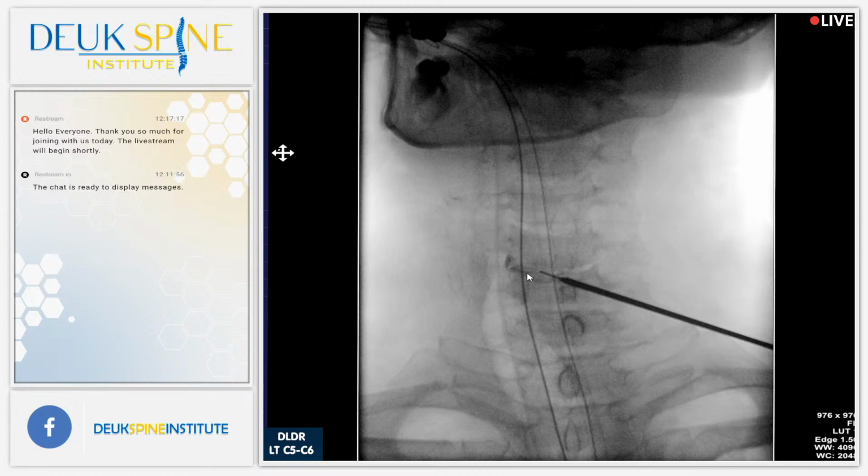Show us the lateral margin of the tear. Yep, right there. Henry captured that as well, screenshot. And then show us the nerve root with dye wrapping around it. There it is. So you can see how the nerve root, and it's a dark thing. See the nerve root right there? That's the nerve root. Look how close it is to where the tear is. You see that? The tear leaks inflammatory juice onto the nerve root, causing arm symptoms and shoulder pain. Great job.